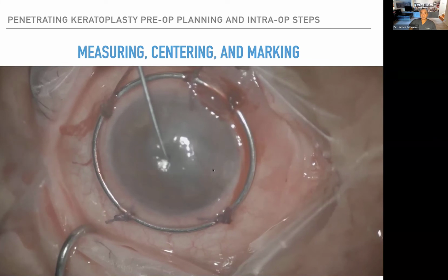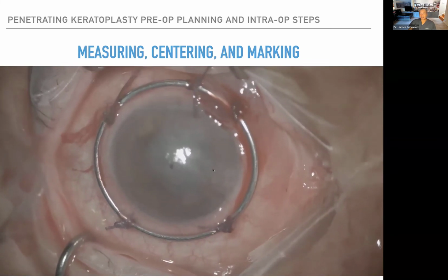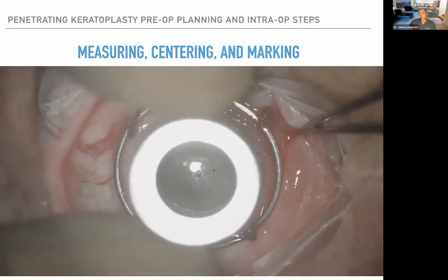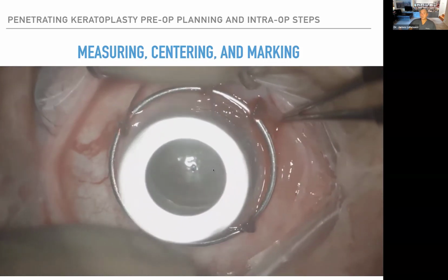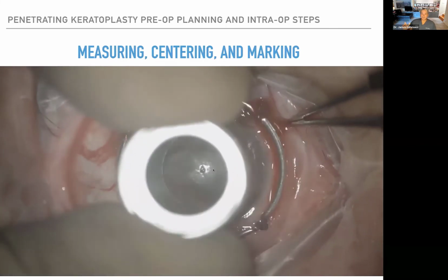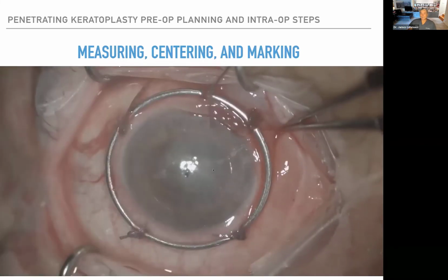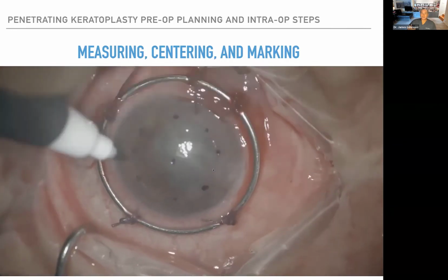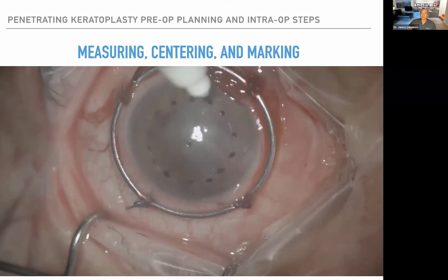That's basically where you're going to aim the trephine, because remember the trephine has a target on it. Now here you're getting a trephine smaller than what you're going to trephine the cornea with. Like, you pick a 7 if you have a 7.5. Then you're going to center that and indent it on the epithelium, and then use a marking pin and mark a circle. This is just to help you center. And as you get better, you don't have to do this.